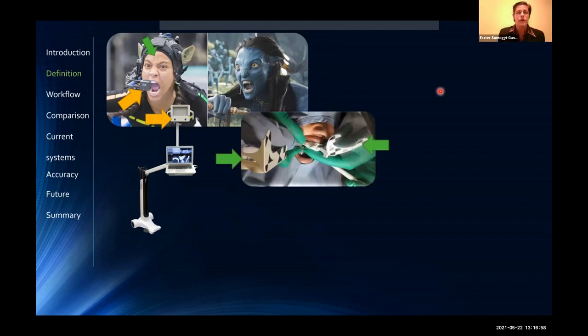You also see that the way this technology is carried out, there are markers. For instance, on this individual's face, there are markers that are going to be detected by this camera, and that's how it is translated by the computer to the character. Now, in our case, the markers are usually attached to the patient in some way, or there are some other systems, and I'll talk about this with the Navident system, how else you can correlate the patient to the CBCT.